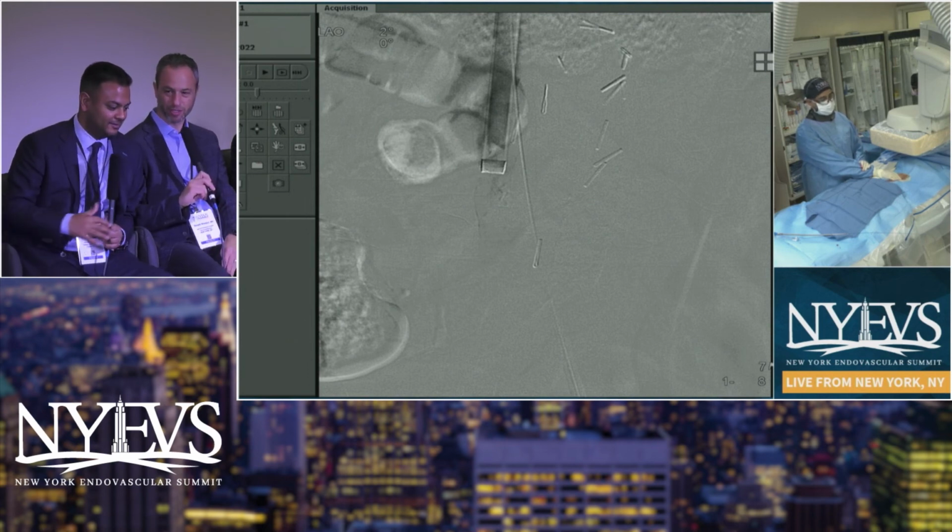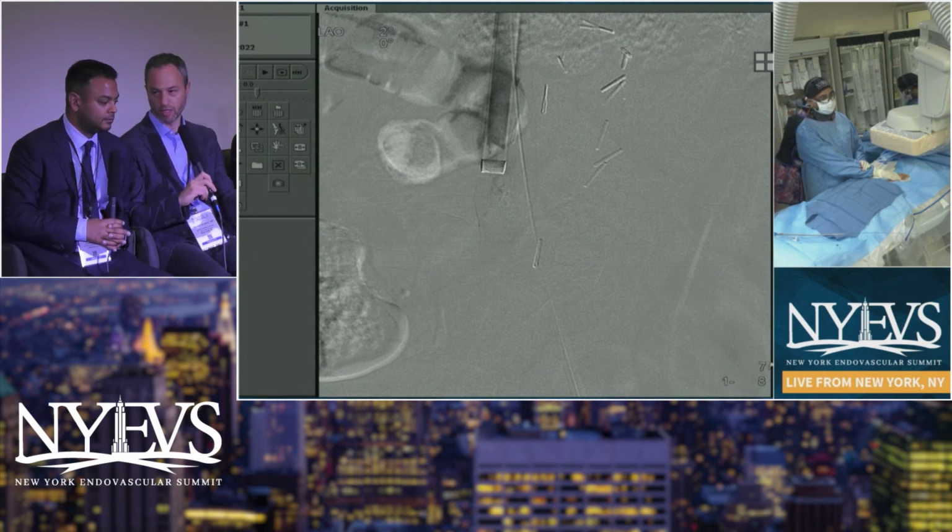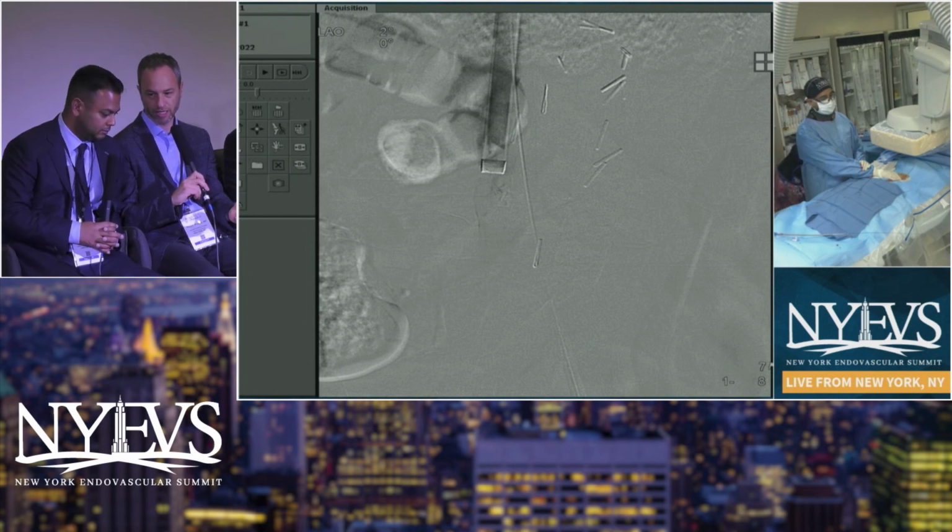I think some of the hardest part is when do you bring these patients for removal? If somebody has a chronic filter, you know it might be challenging to remove, but they're not on anticoagulation. I think, like you're saying, we should be trying to be more aggressive and at least evaluate those people and discuss with them the possibility of filter retrieval.